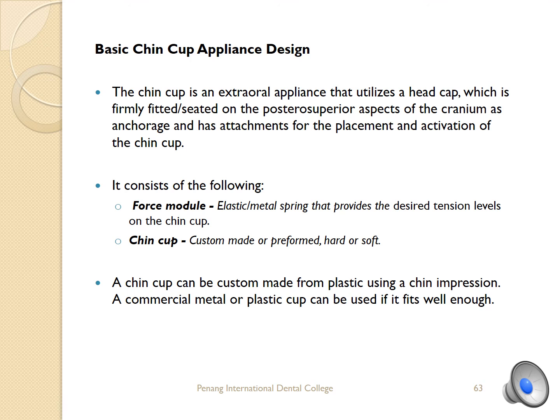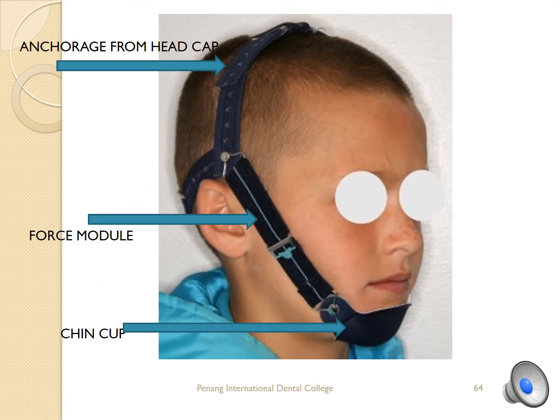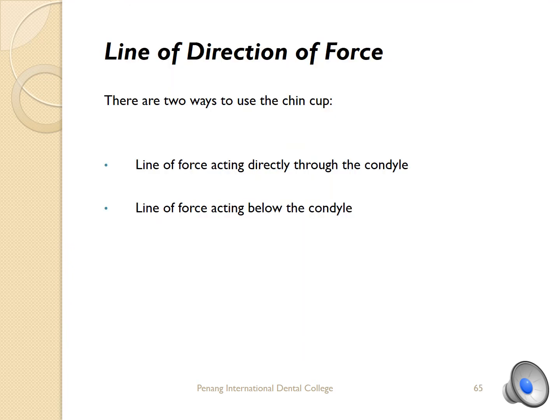A chin cup can be custom made from plastic using a chin impression. A commercial metal or plastic cup can be used if it fits well enough. So this picture shows the components of the chin cup. We have the anchorage for the head cap, the force module and the chin cup. Then, the line of direction of force.